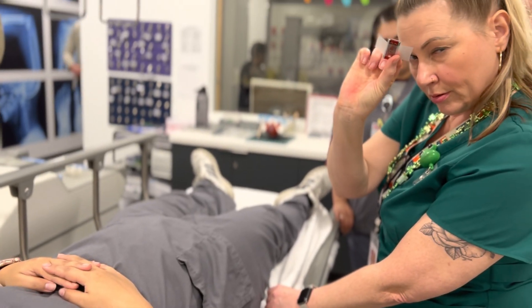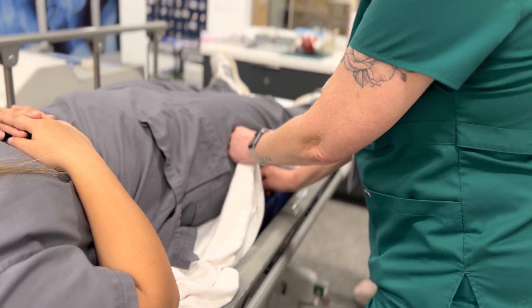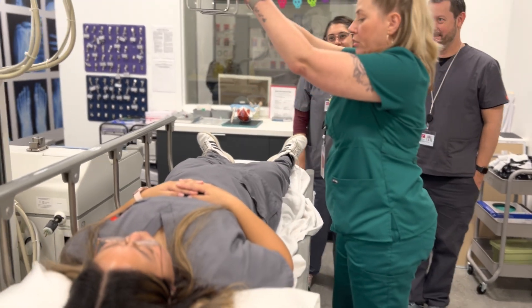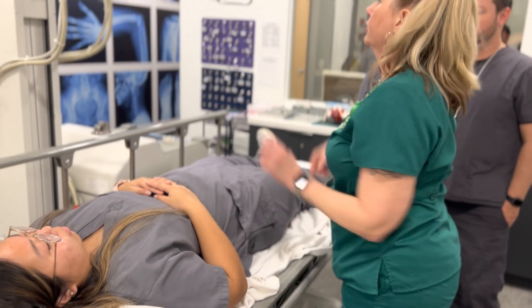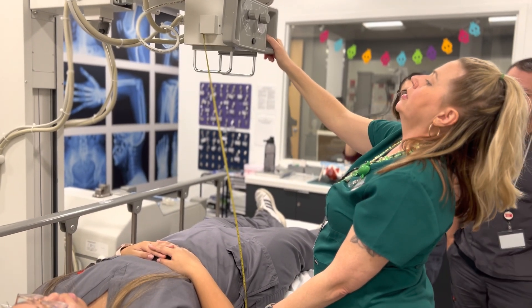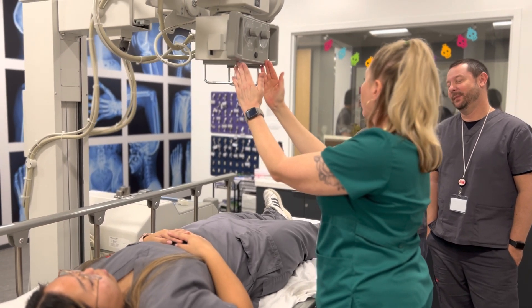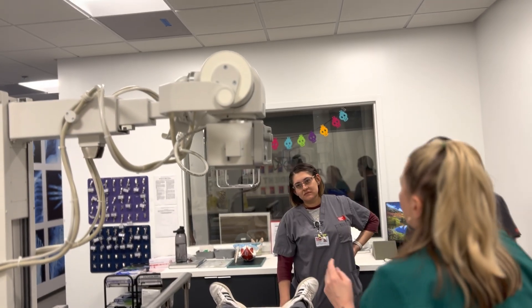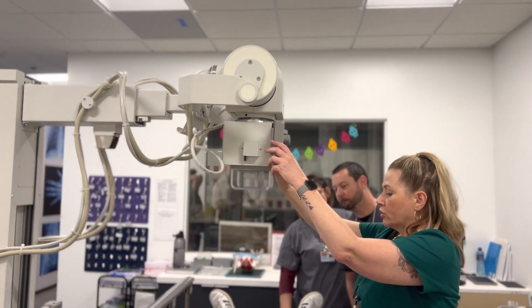Before I do that, I put tape on my marker and put it underneath at the bottom. Now I bring the tube over and turn it on. I'm putting the top of the light at the top of the IR, and then the bottom of the light at the bottom of the IR. My SID is 40. I'm checking for both planes — I check this way and at the head or at the bottom. The tube was tilted a little bit, so I undo it. Make sure that I'm at the MSP.